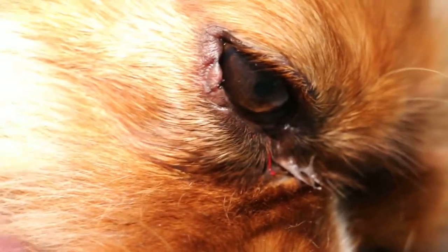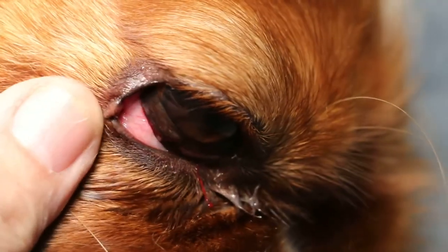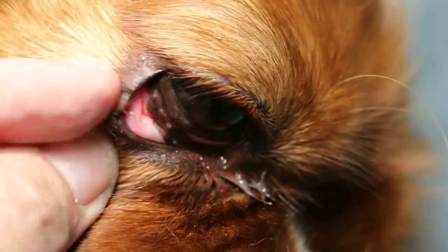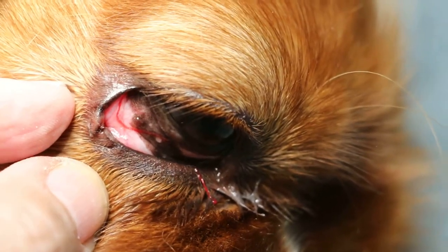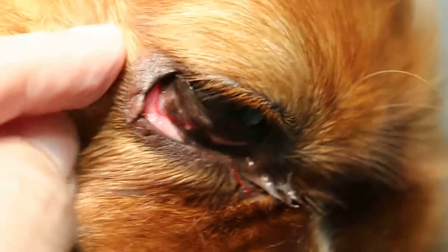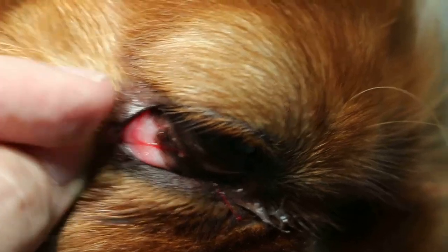Electrosurgery to excise the abscess inside the palpebral conjunctiva and coagulate it, so that there won't be another pimple coming out again. This is best done using electrosurgery. The dog is under general anesthesia and the approach is from the inside of the palpebral conjunctiva, from inside there.